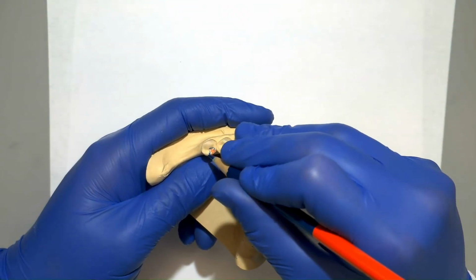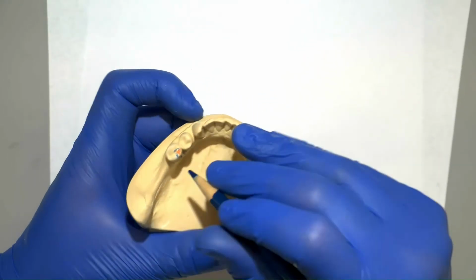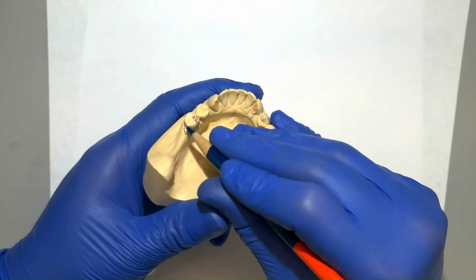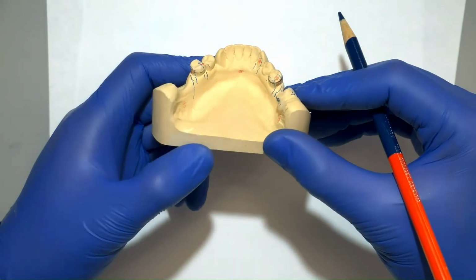On the other side, here is the mesial rest of the modified T, coming down with a slim minor connector here, and then we'll cover this guide plate on the other side. Again, remember that last one is going to be the actual start of the finish line, so we're going to take that down a little further like that.